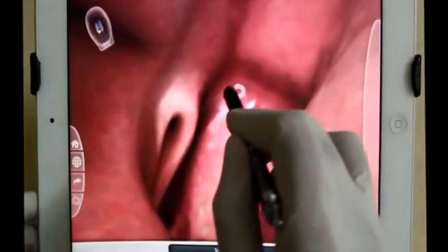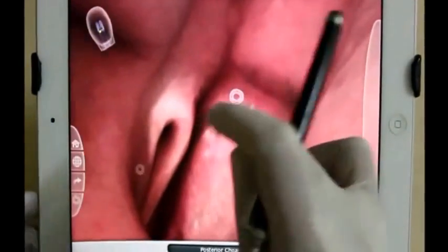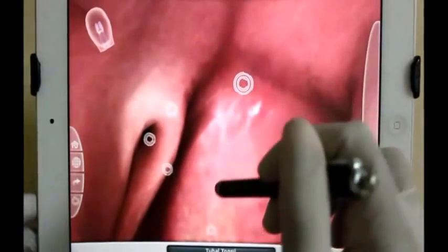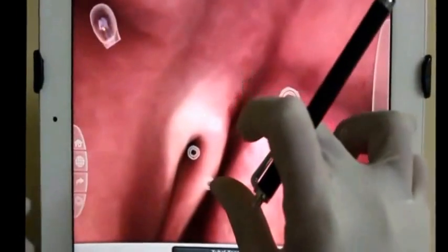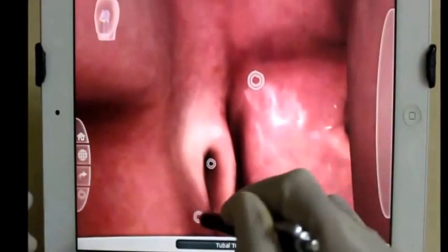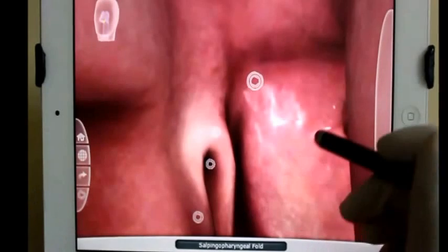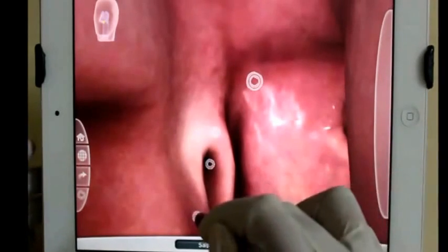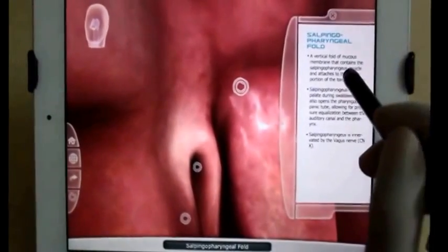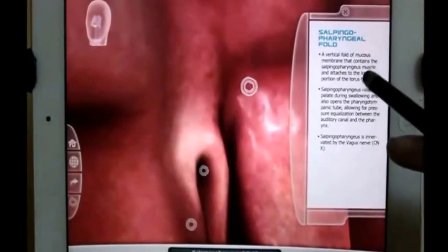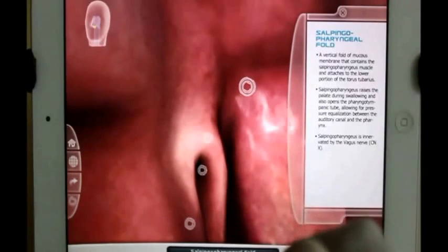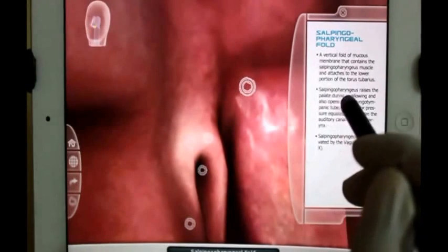Moving forward. This is the tubal tonsil, which is part of Waldeyer's ring — I hope you are aware of it. And this is the salpingopharyngeal fold. It is a vertical fold of mucous membrane that contains the salpingopharyngeal muscle, attached to the lower portion of the torus tubarius.